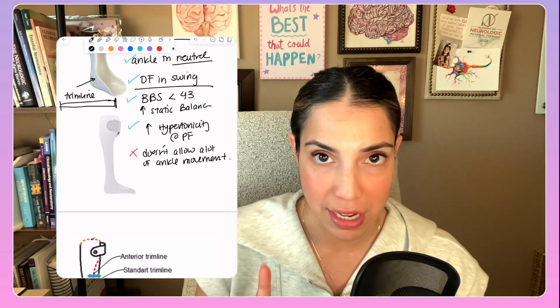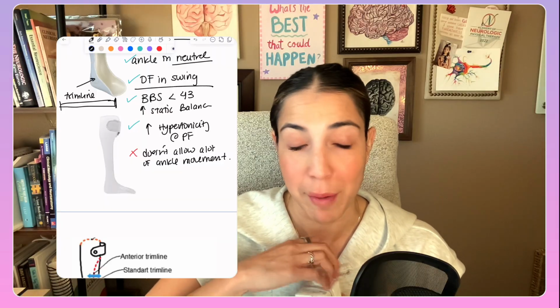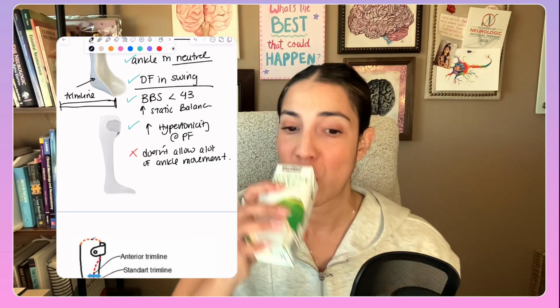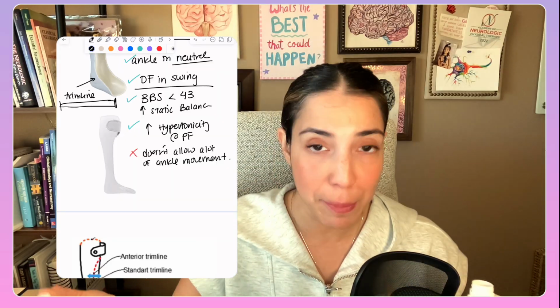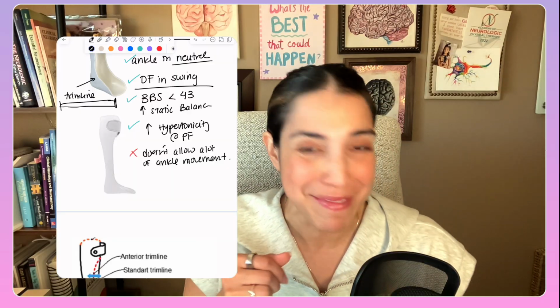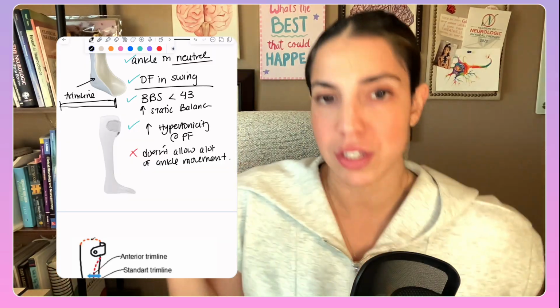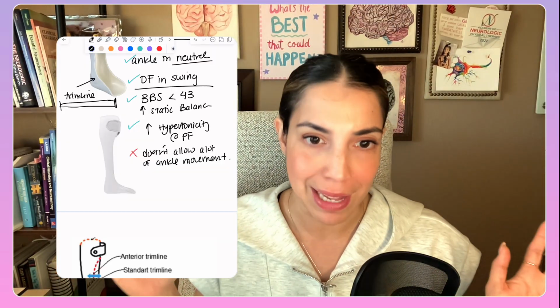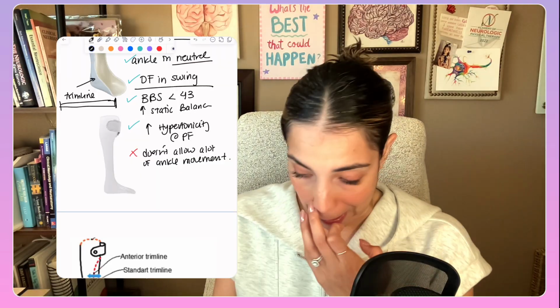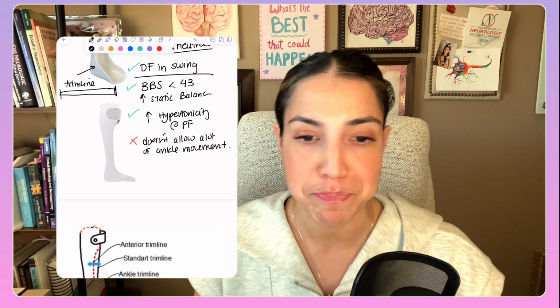Now, by the way, I learned this in residency. I'm not brilliant, but I didn't know what polypropylene meant. Polypropylene, is that how you pronounce it? Polypropylene means plastic. It's a plastic. And they also use the word thermoplastic, I guess, because they mold the plastic under heat. That's what I'm thinking. But if you're wondering what the heck is polypropylene, it's just plastic. Okay.